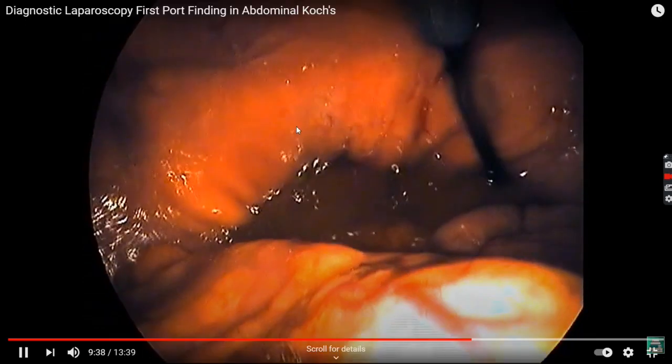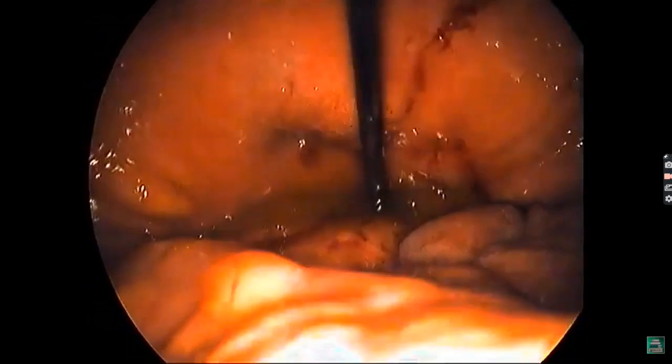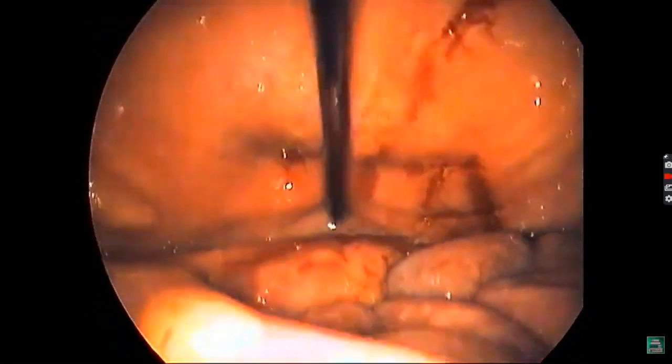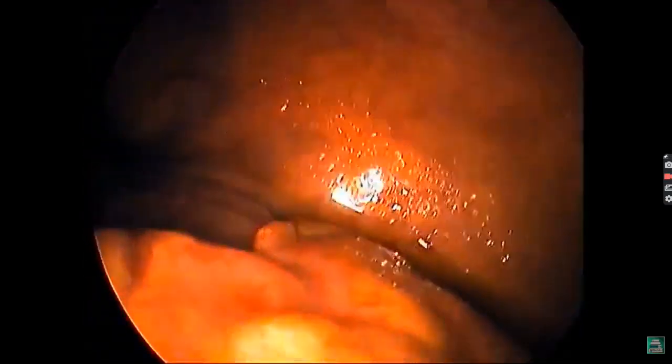So this color of the structures can be corrected by doing white balancing whenever we are taking out the telescope, and before inserting it inside we are always supposed to do white balancing. The white balancing concept we will study in some other video.